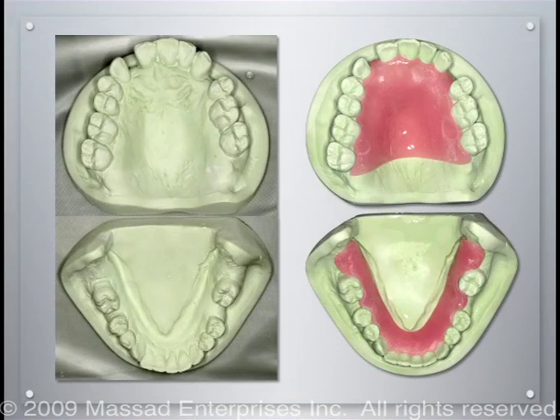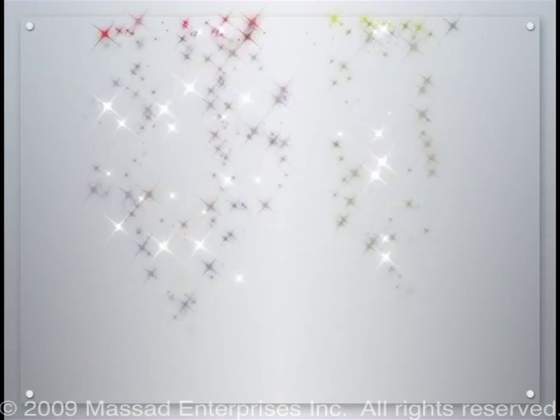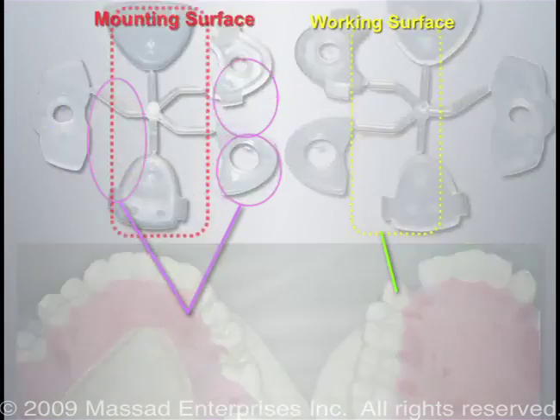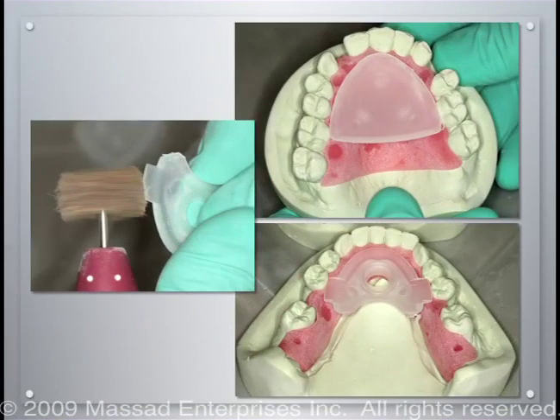It is important that these resin bases do not come over top of the natural dentition. They should be allowed to only be on the lingual surfaces and will be made in order to mount the striking plate to the maxilla and the pen receiver to the mandible. We are now choosing the proper size for both the maxillary and mandibular arch sizes. Make small adjustments in order to assure a customized fit.